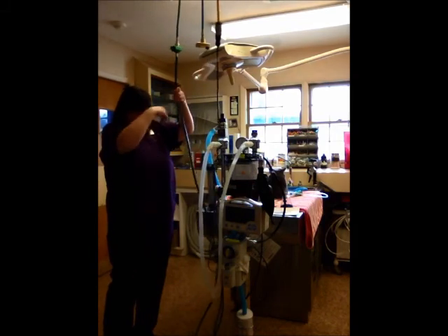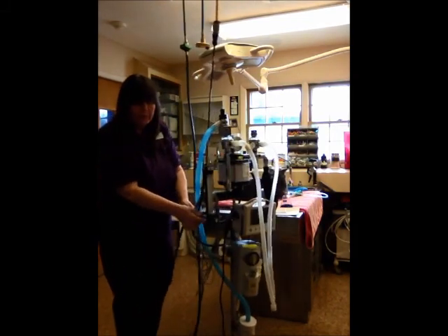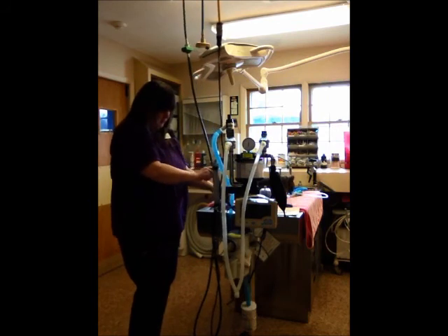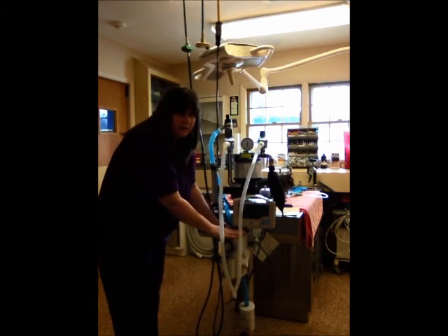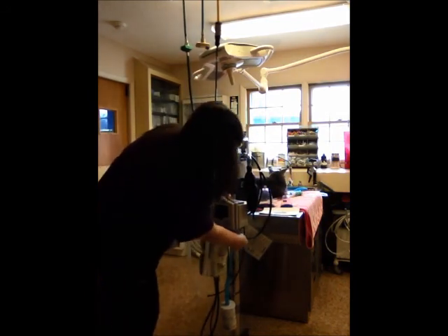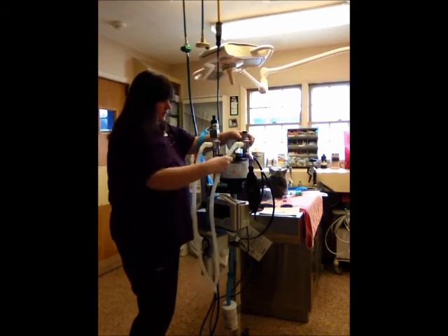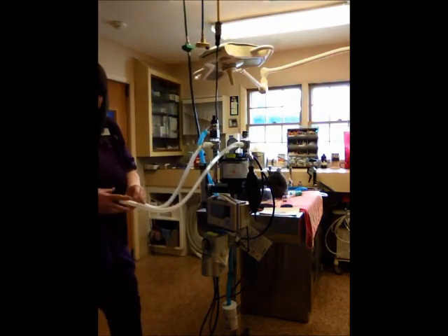This one is a brand new one, so no gas anesthetic has accumulated in it yet. Oxygen leaves the oxygen tank, travels through the tubing, and enters the back of the flow meter at the bottom. When you turn the flow meter on, oxygen travels through it, exits the top, and enters the vaporizer, picking up anesthetic gas. It leaves the vaporizer, entering the inhalational valve. Some of the anesthetic gas will go into the bag, and some will go into the inhalational tubing, which will then go into the patient.